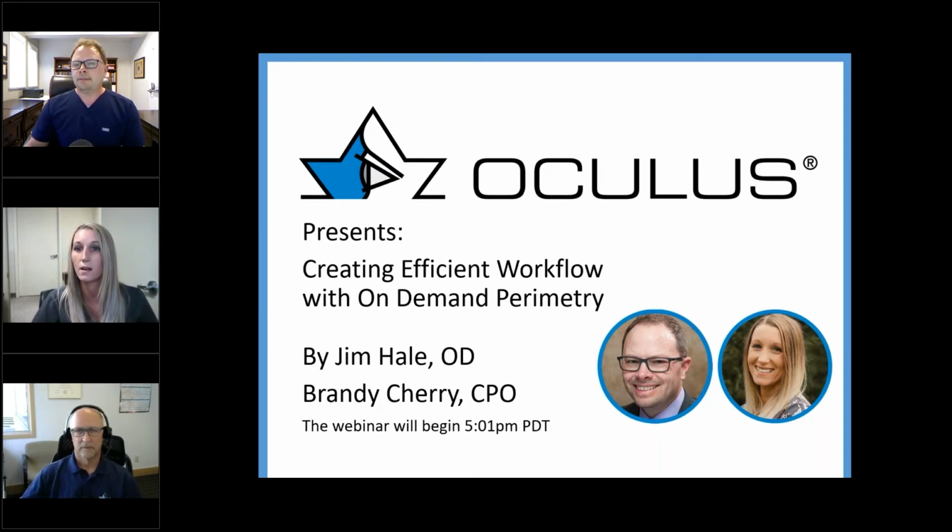I agree. So while Dr. Hale, just so I can give you the technician perspective, while Dr. Hale has left the room and he's paged us, we have a paging system. We'll get the page stating that we need to do an on-demand perimetry. So we'll go clean the system really quick, get the patient's name in there. We tell the other technicians that we're going to be busy, we're not going to be available. We get another page stating, okay, I'm ready.